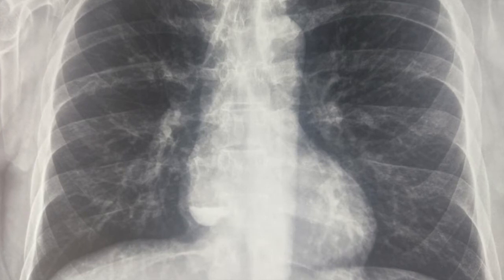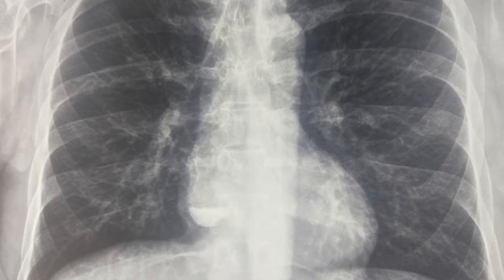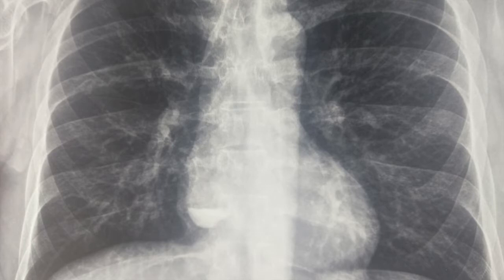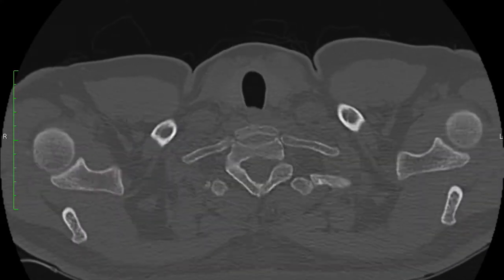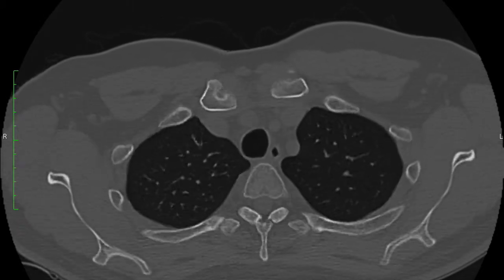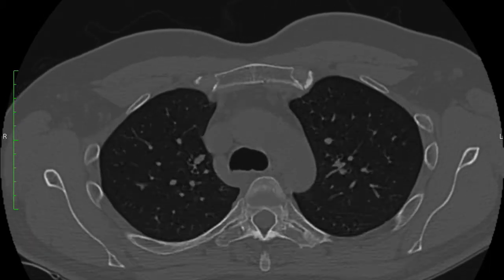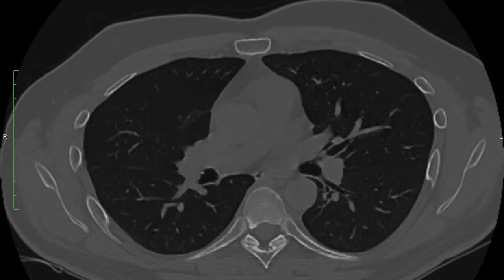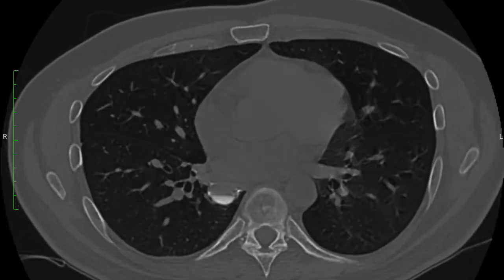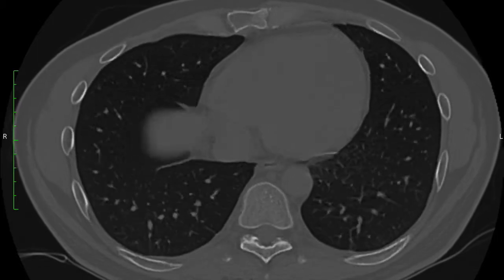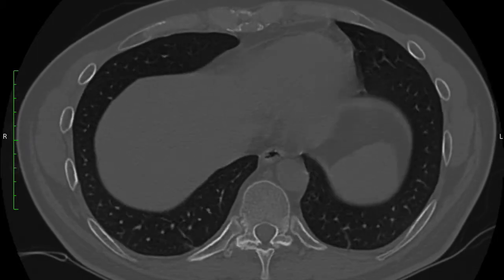However, to best determine what we do next, a CT scan is performed — a regular CT with contrast. The first window is a bone window to better visualize the densely calcified lesion. We can see that it is located in the lung proper, on the right side posteriorly, and it looks smoothly outlined.